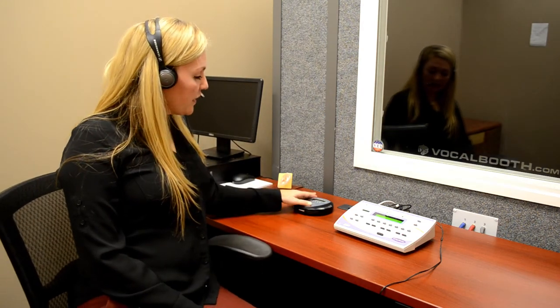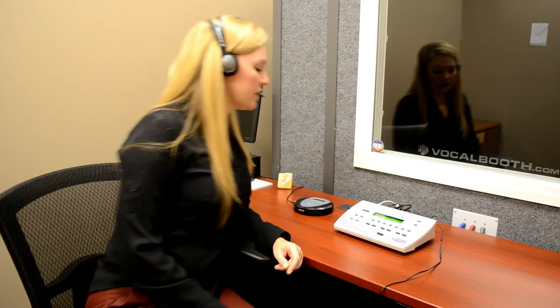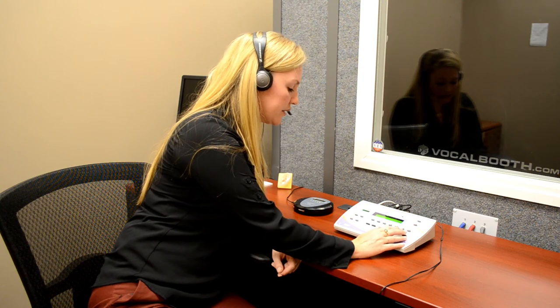So now we're going to go ahead and press the play button, and usually the CDs will start out with a calibration tone, and so now I'm just going to increase the level until I get to 0 dB.